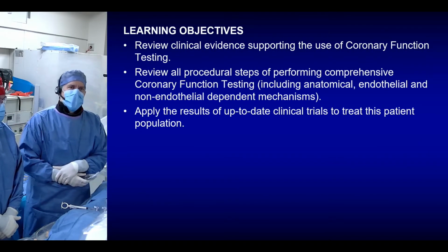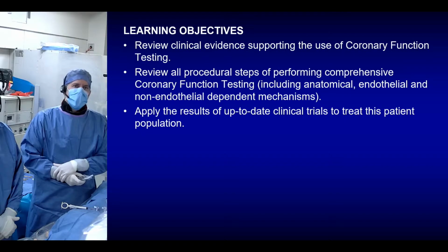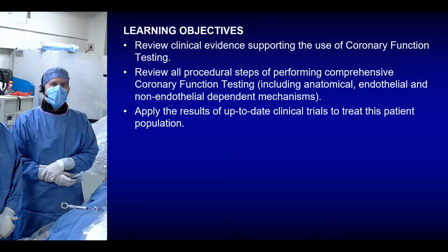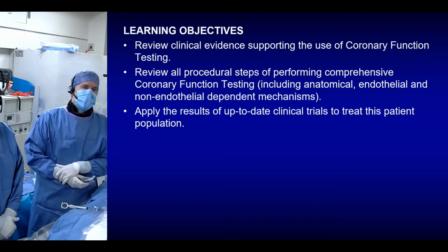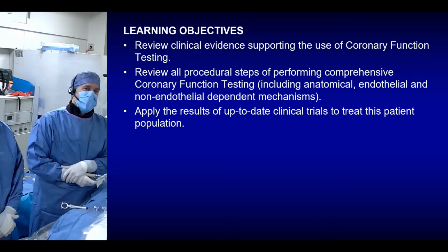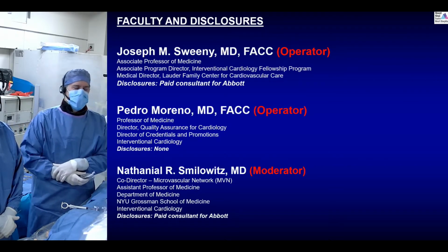So the learning objectives, like I mentioned, we're going to review the clinical evidence supporting the use of CFT. We're going to review all the procedural aspects and steps of performing it, including the anatomical, endothelial, and non-endothelial dependent mechanisms. And then we're going to apply the results of up-to-date clinical trials to help treat this patient population. And I've picked one case here, which I think is very illustrative.